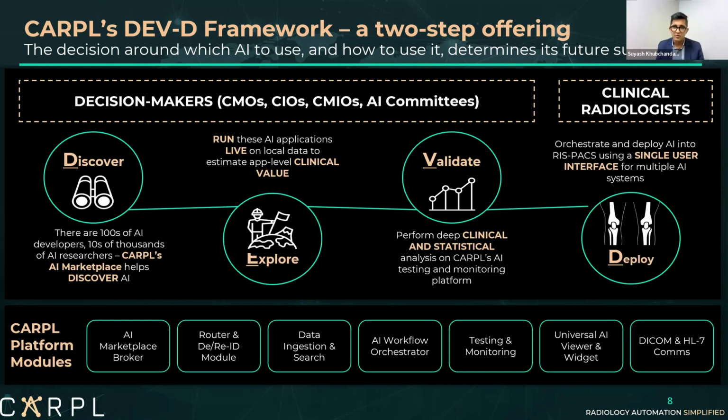I think that's a very good question. Atharv, do you want to take that? Absolutely. Answering his second question with regards to there being levels, yes, there are absolutely levels to these AI applications that are approved for clinical use. This is based on the regulatory approval that they receive, based on how critical these AI applications are.